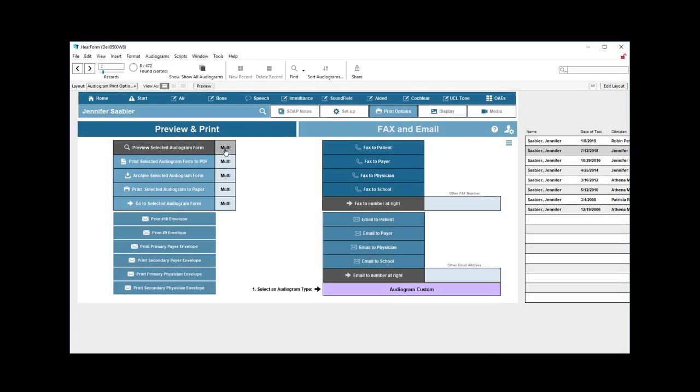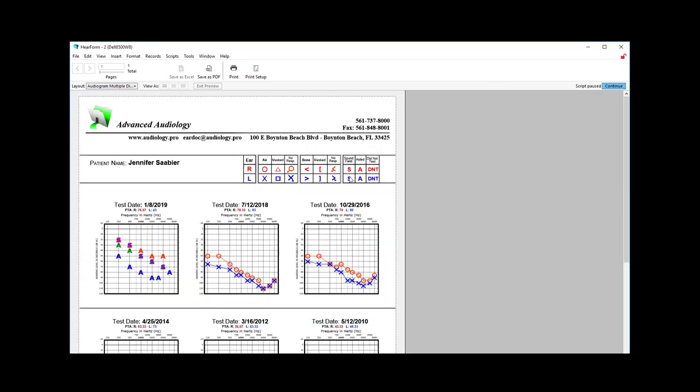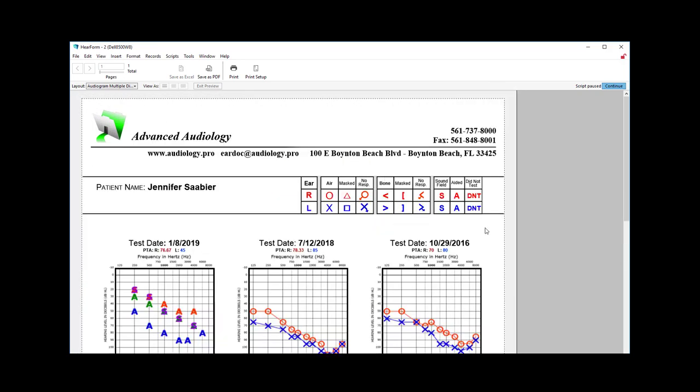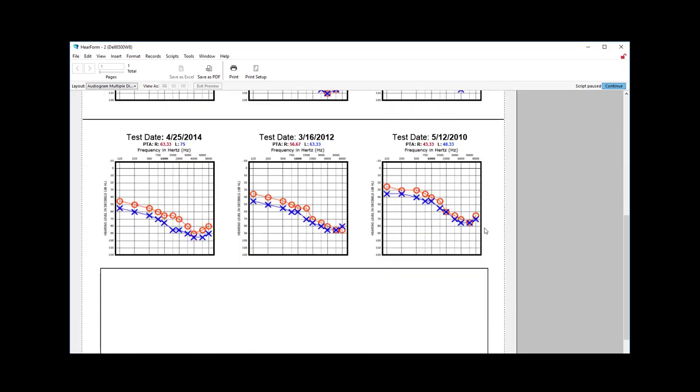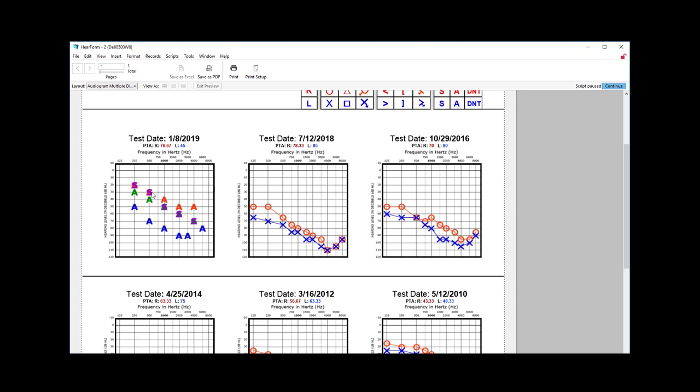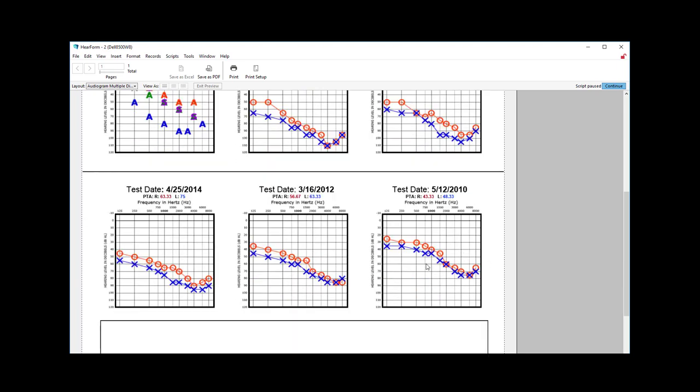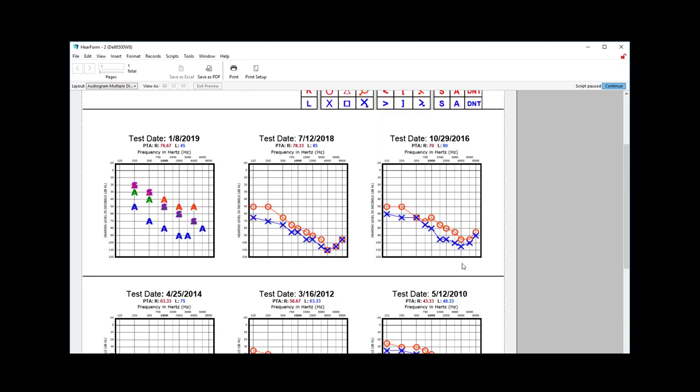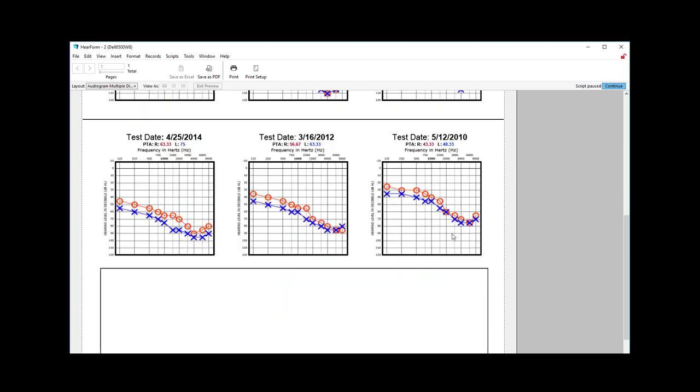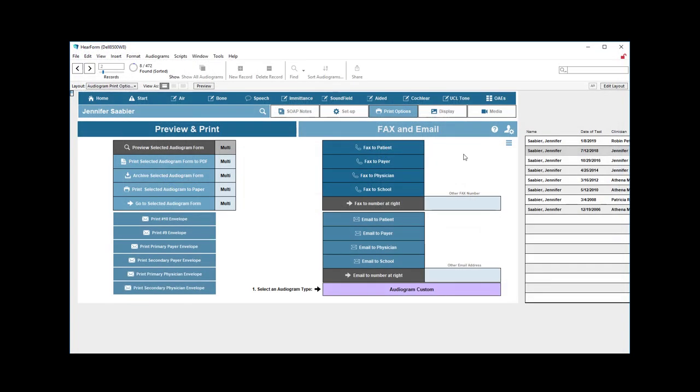If we click multi and then zoom in a little bit, you can see that you can print up to six different audiograms. Now this one's a mess on the left because I was just playing around with that for training purposes, but it would show six audiograms, and that way the physician or patient can see how their hearing was a few years ago, and it's gotten a little bit worse over the years, whatever it is, and you have a much larger area for comments if you've included any comments. So that's multi.